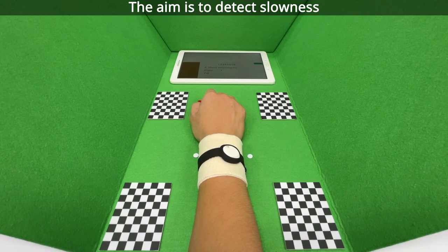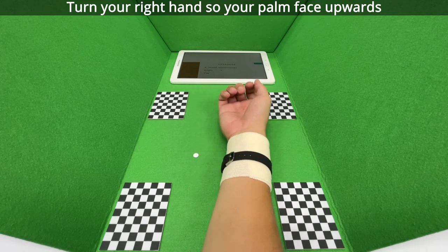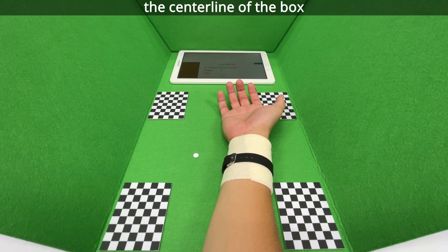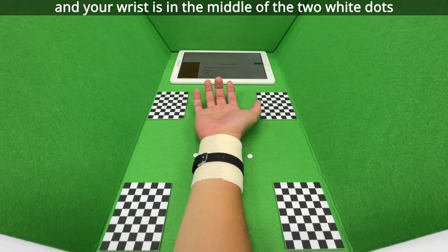The aim is to detect slowness. Turn your right hand so your palm faces upwards. Ensure that your arm is aligned with the center line of the box and your wrist is in the middle of the two white dots.